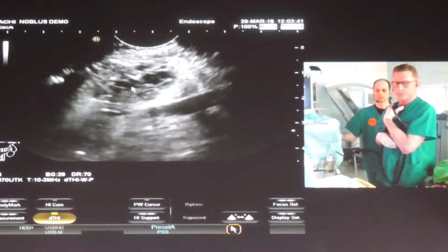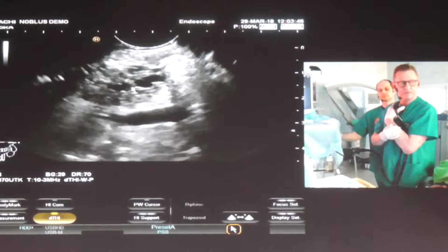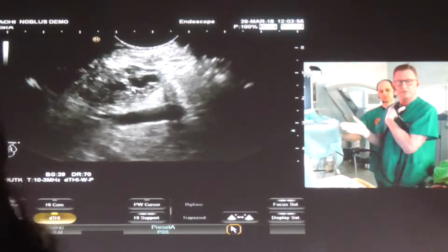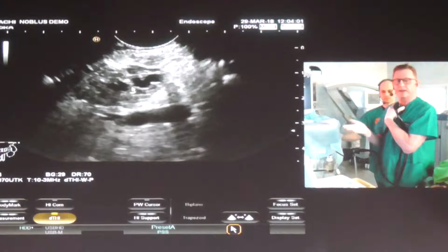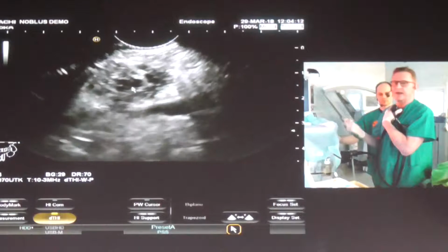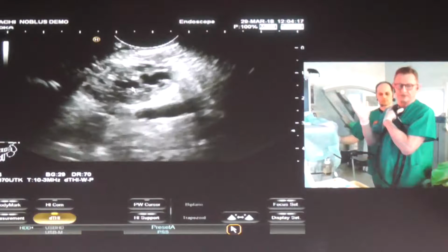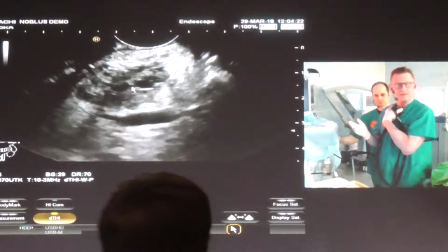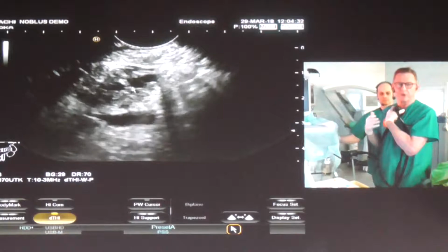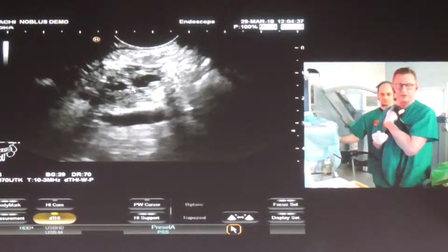Is it really necessary to puncture such a lesion to confirm the diagnosis? You know, this is a field where we really need progress, because imaging-wise, I'm only 50% sure that this is a serous cystadenoma. It can still be a mucinous cystadenoma. Then we have the possibility to biopsy and to do CEA analysis. With CEA, we are able to go up to 60% to differentiate whether it's a mucinous cyst or a non-mucinous cyst. The treatment is, of course, quite different. If we know that this is a serous cystadenoma, there's no need to go into surgery. If we know it's a mucinous cyst, we have to do a surgical procedure for the patient.